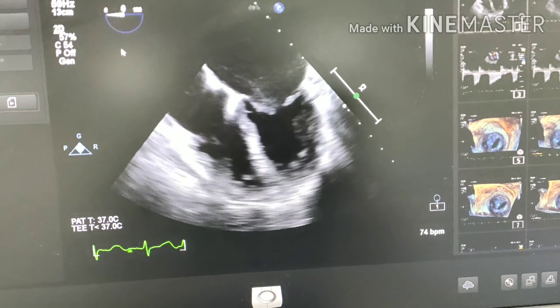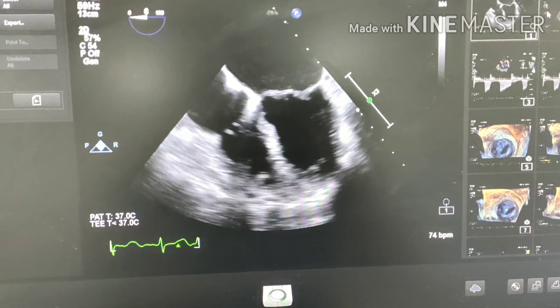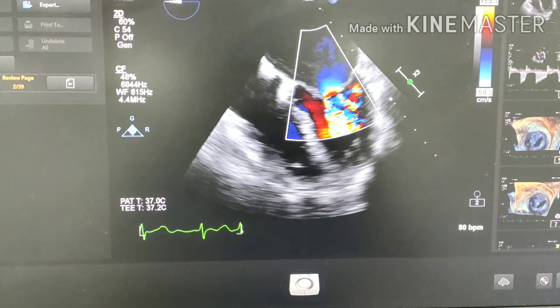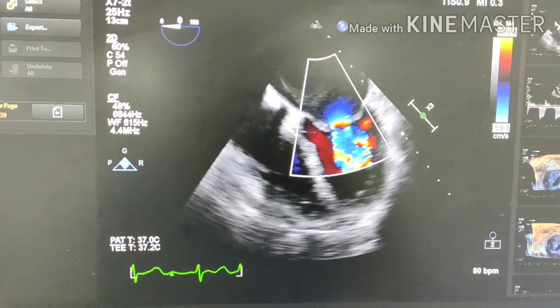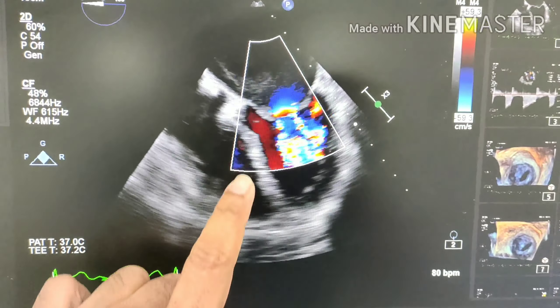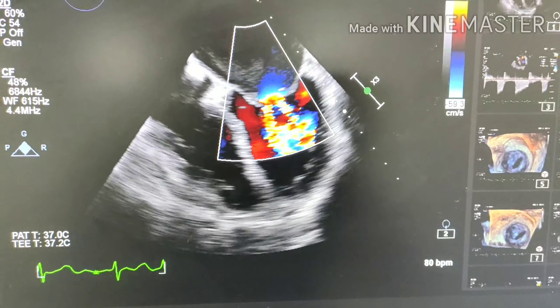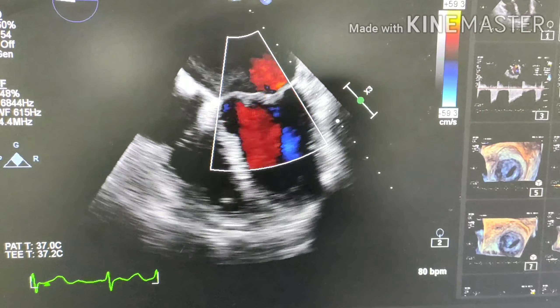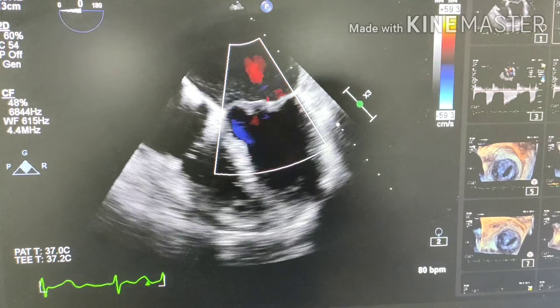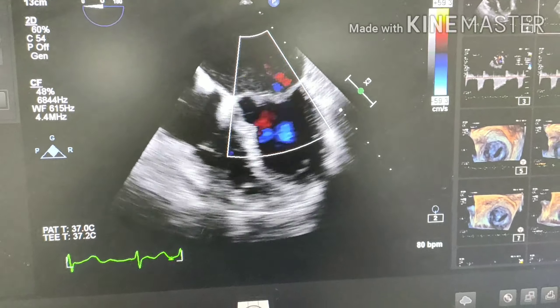Let's put color on that. You can see the severe aliasing in the mitral inflow under color flow Doppler, which actually tells you the patient has significant mitral stenosis.